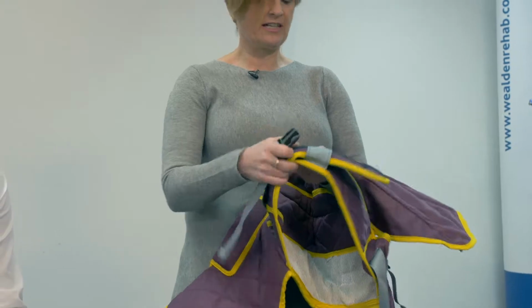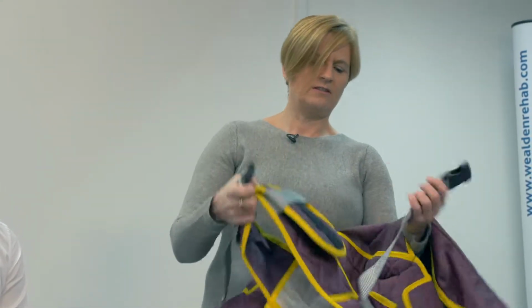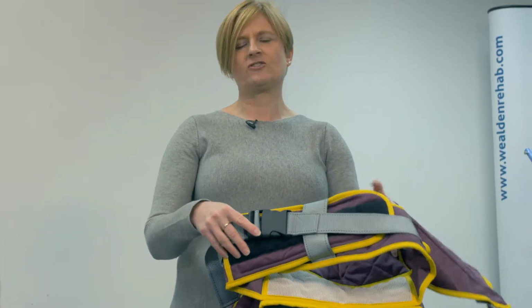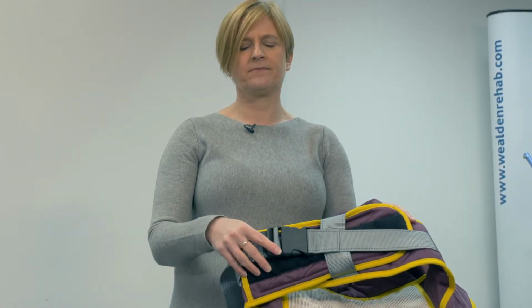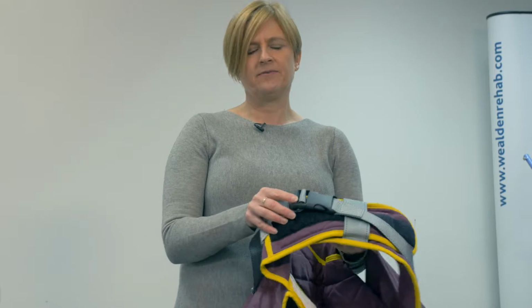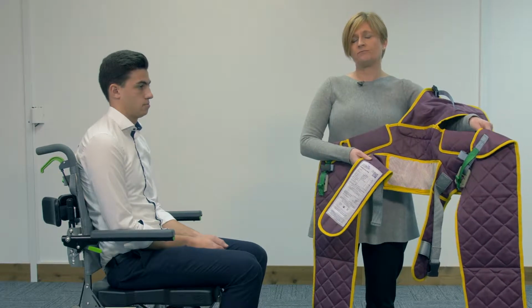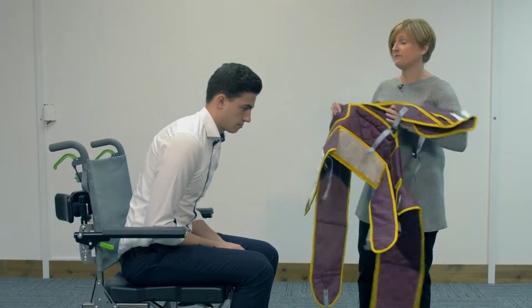You then use the clip belt to hold the Velcro and chest strap in position securely. A toileting sling is really useful for somebody who has good head and trunk control. To assess that someone's got good trunk control, they need to be able to sit forward in the chair for you whilst you're fitting the sling.